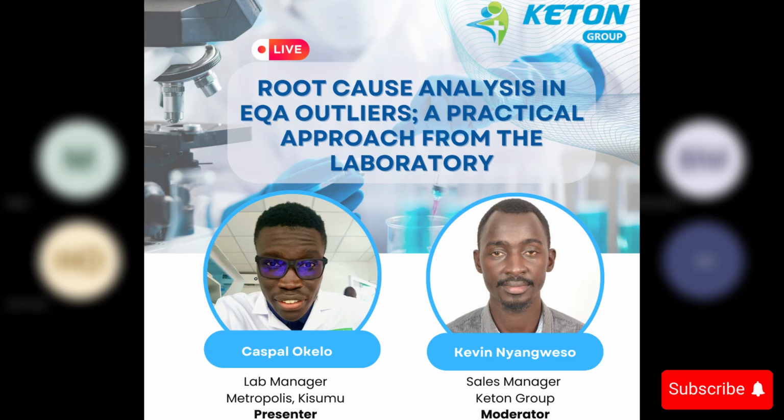Okay. Omar is asking, please comment on preventive action and risk analysis and their role in non-conformance management as far as ISO 15189:2022 is concerned. Thank you. I'll give a brief comment. ISO 15189:2022 clauses 5.6 and 8.5.1 tell us about risk analysis. Clauses 8.5.2 and 8.6 mostly tell us about preventive action.